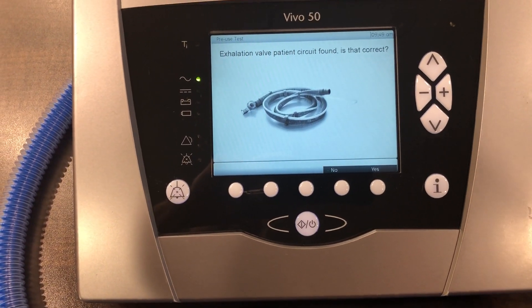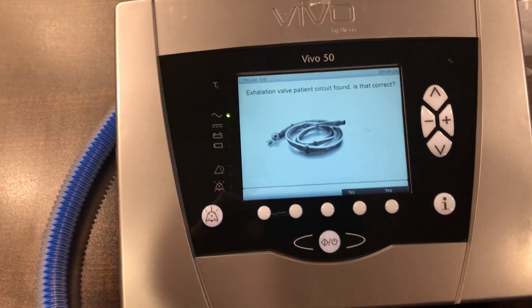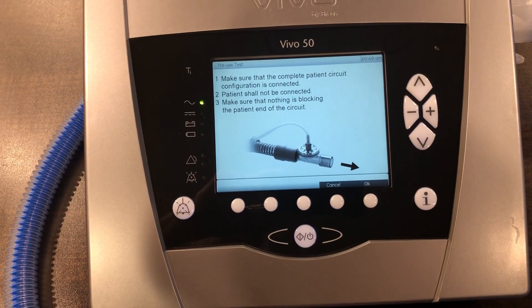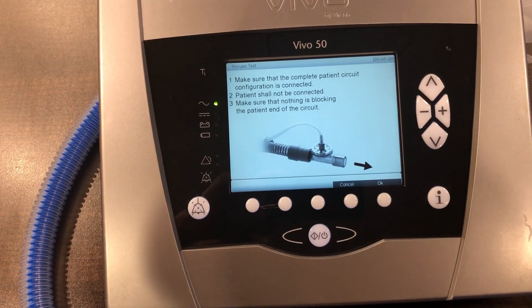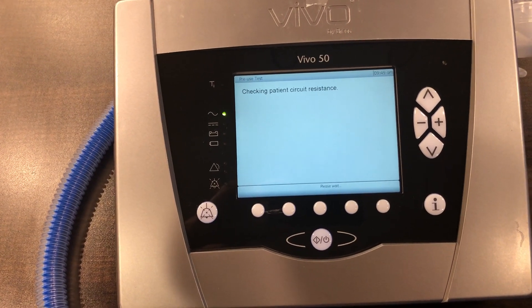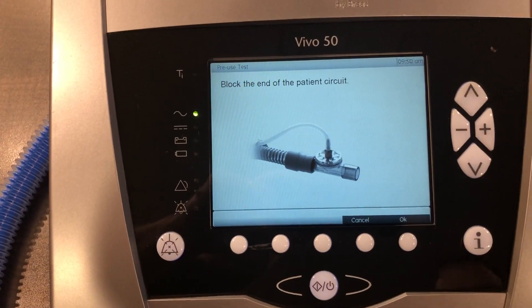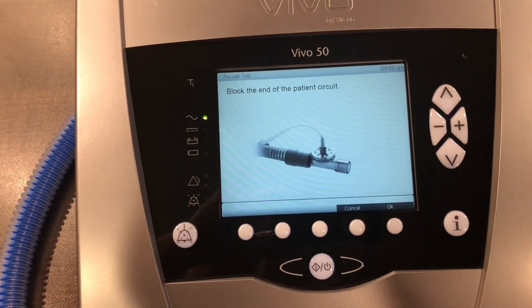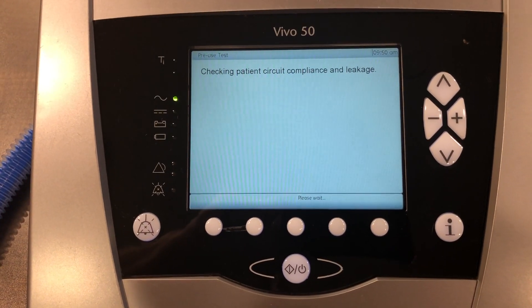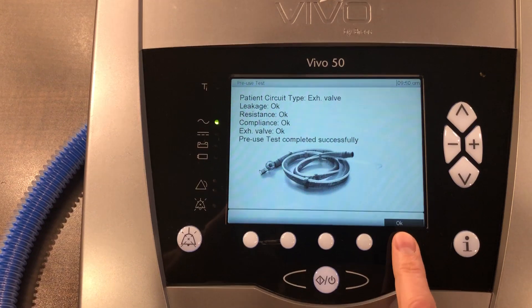The unit has recognized that we have an exhalation valve. What we've got here is a single limb circuit with exhalation valve — is that correct? Yes. So now we're just going to follow the prompts. Make sure that the complete patient circuit configuration is connected, patient shall not be connected, and make sure that nothing is blocking the end of the circuit. Press OK. And as you'll see, we passed our test. Again, press OK.